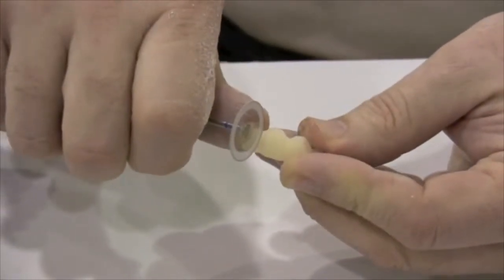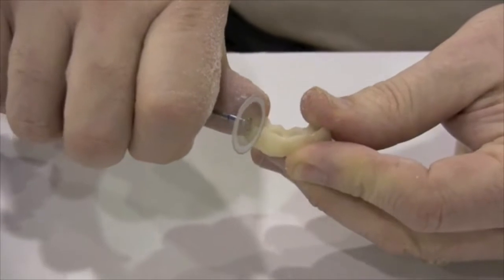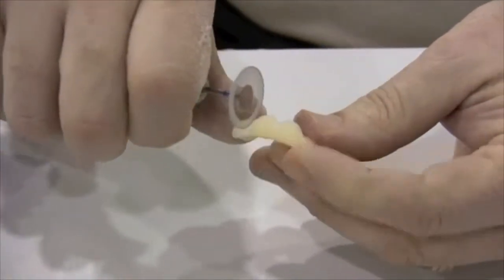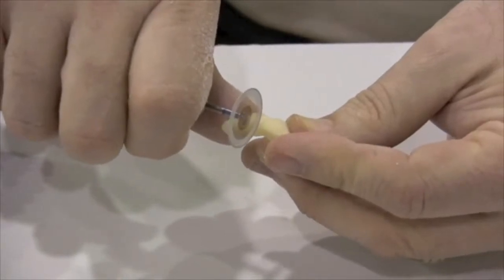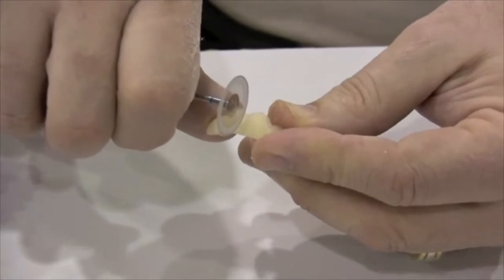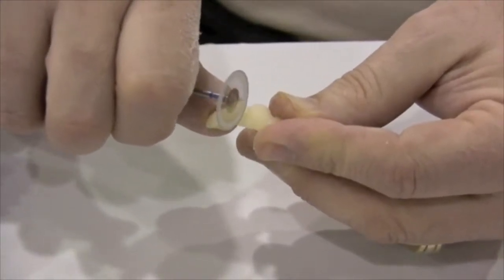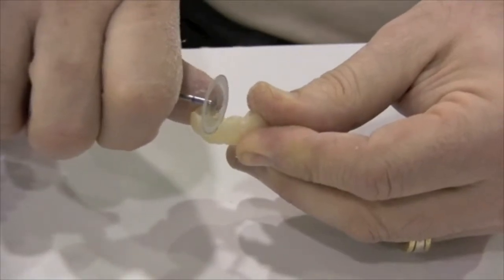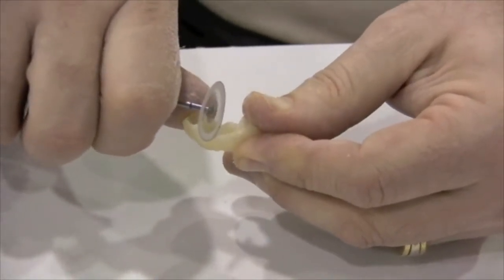Now the final restorations are all going to be single units, but for convenience, most of the time what we will do is splint these units together in the provisional phase.